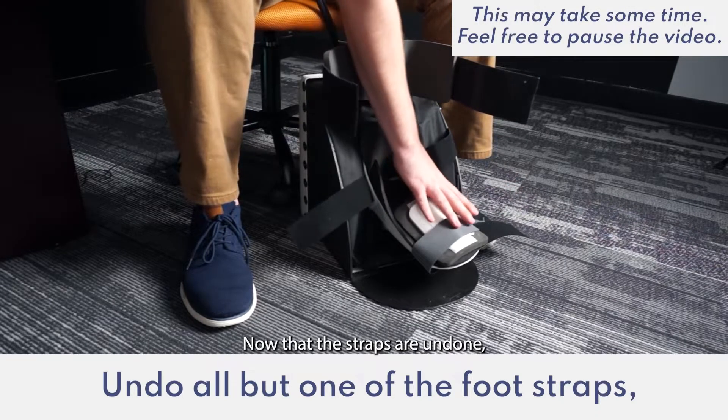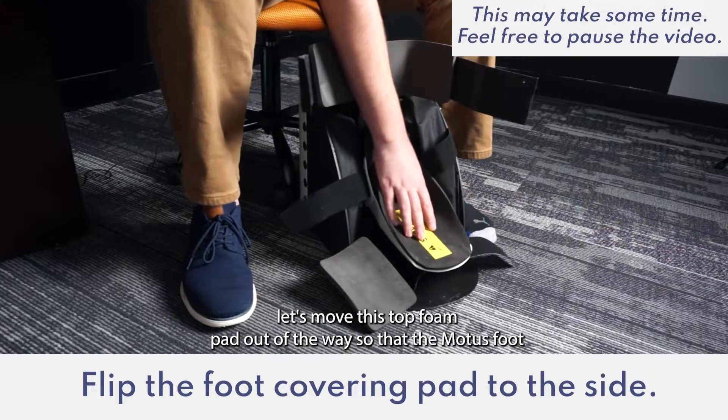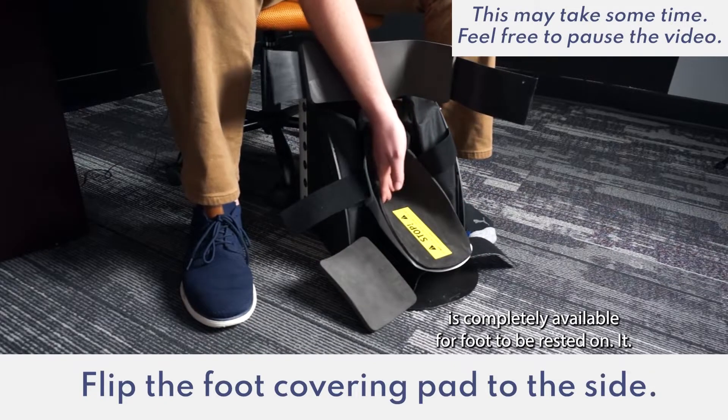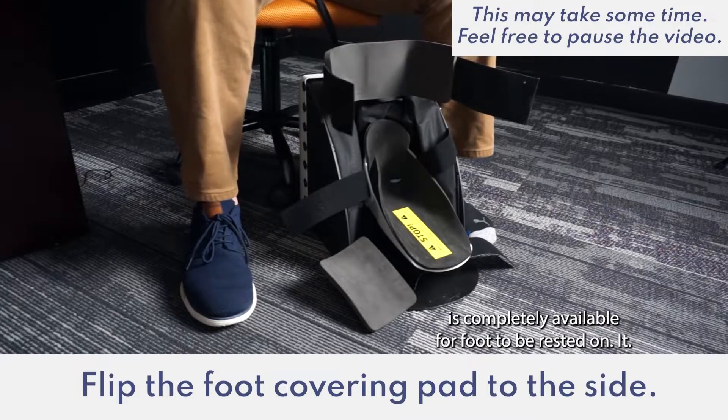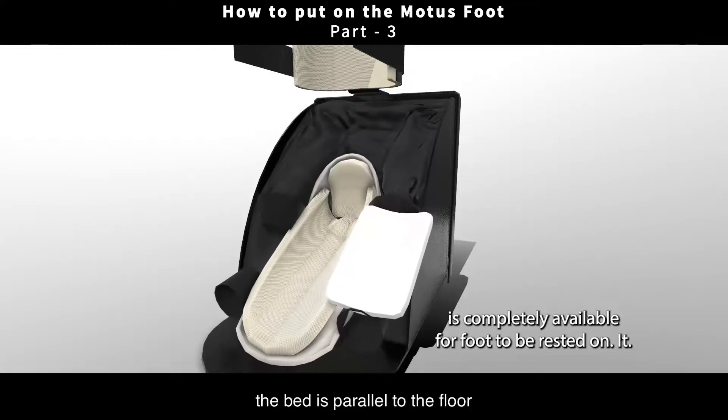Now that those straps are undone, let's move this top foam pad out of the way so that the Modus Foot is completely available for our foot to be rested on it. Wait for the footbed to pump up so that the bed is parallel to the floor.